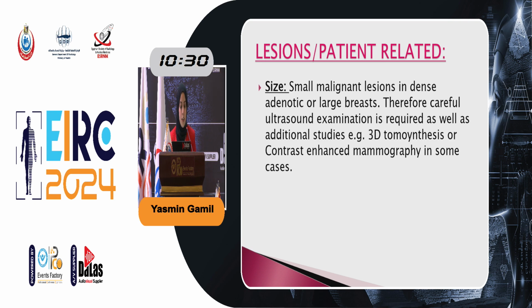Lesion-related factors include the size of the mass or the breast. Small malignant lesions in dense adenotic or large breasts are easily missed. Therefore, careful ultrasound examination is required, as well as additional studies such as 3D tomosynthesis or contrast-enhanced mammography in some cases.